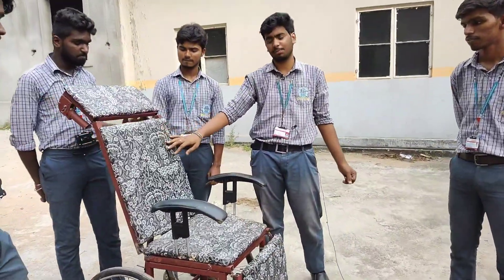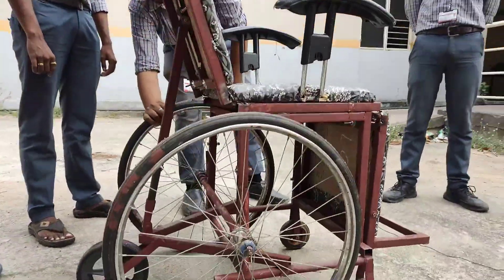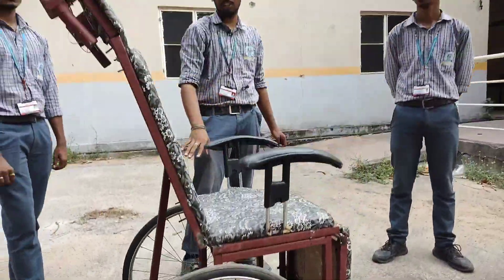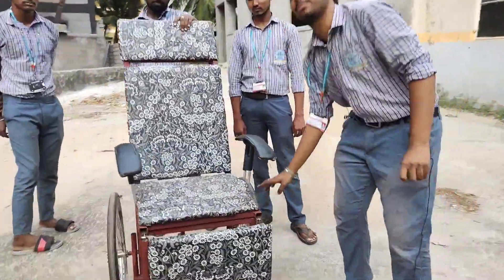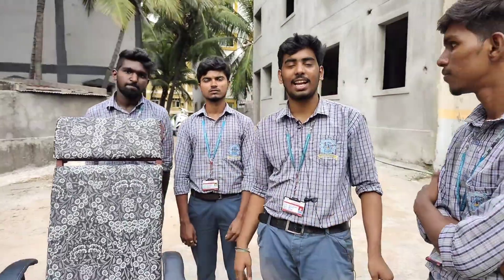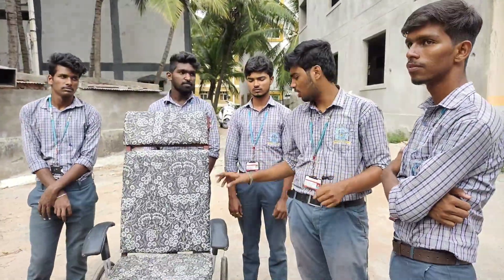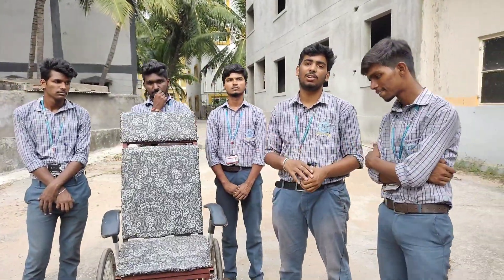This is the backrest and it is provided with a linkage. These are the wheels where the whole setup is based, and this is the axle where the wheels are supported to each other. These are the components of our project and we sourced them from scrap — we made the best out of waste.